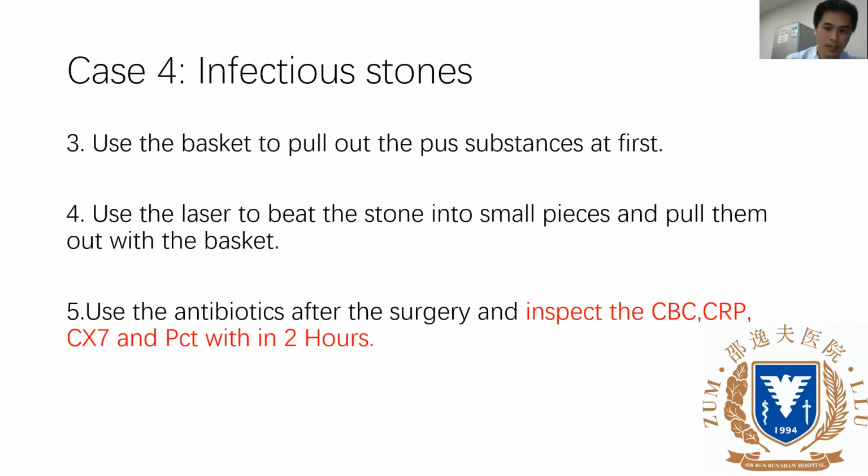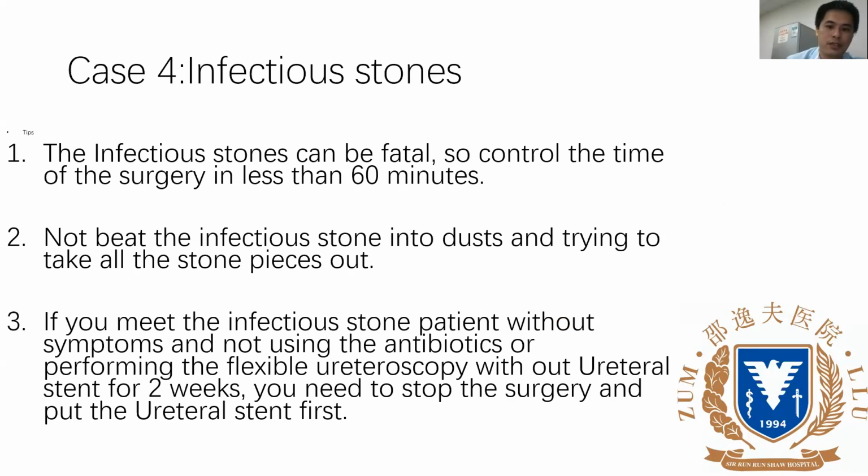So here are some tips. Infectious stones can be fatal, so control the time of the surgery to less than 60 minutes. And in these cases, do not break the infectious stones into dust, and try to take the smaller stones out, because dusting will push the bacteria further into the pelvis and into the blood.